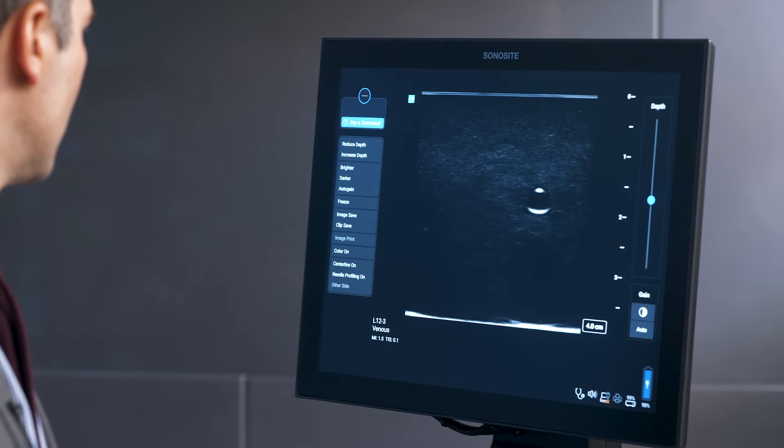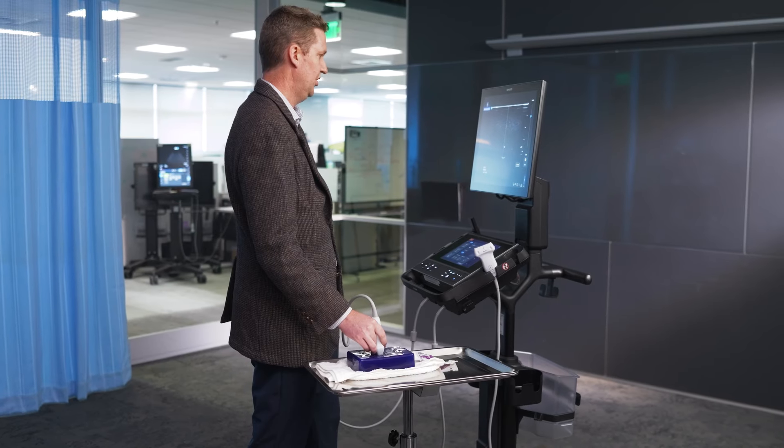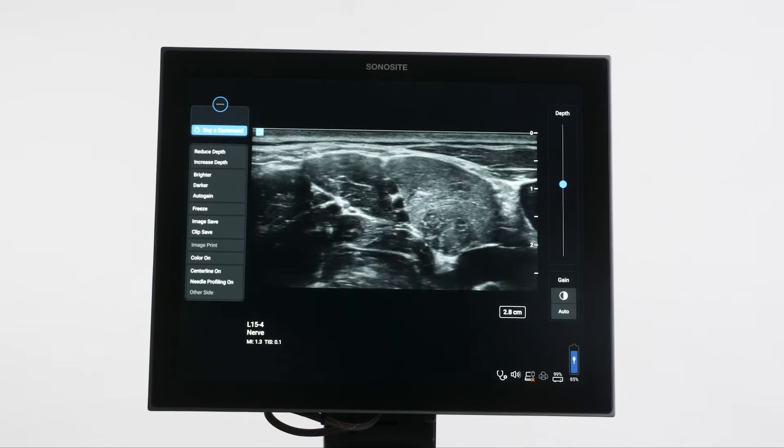Activate voice. That's really fast. Centerline on. It makes an easy to use machine even easier. This is perfect. Fujifilm's Sonosight Voice Assist — redefining ease of use.